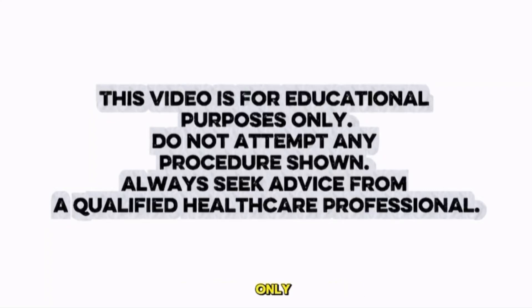This video is for educational purposes only. Do not attempt any procedure shown. Always seek advice from a qualified healthcare professional.